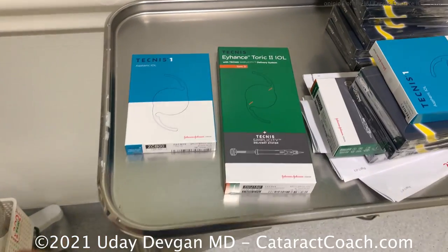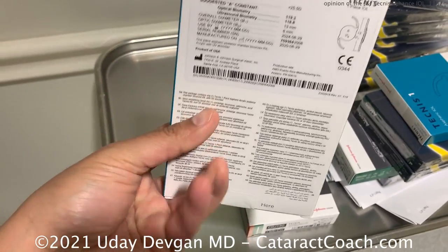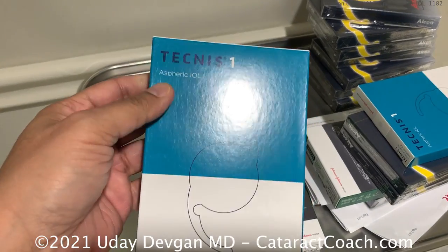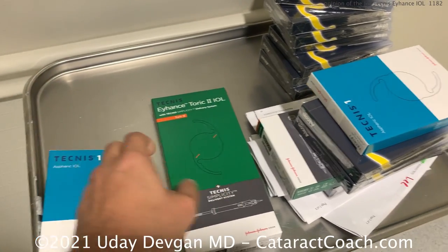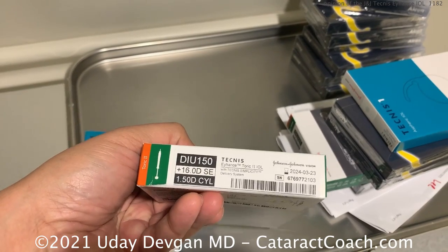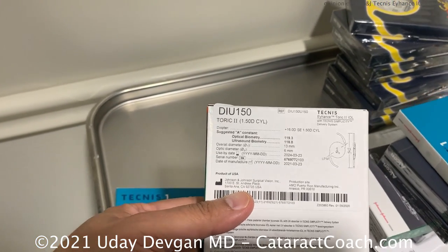So here we have the two lenses. There's the Technus ZC-B00 — the one with a long track record and excellent outcomes. It's a good lens, and we've enjoyed using it for many years. We'll continue to use it if we really want to emphasize the very best visual quality. Now, if patients are willing to sacrifice just a tiny bit of that far distance quality for slightly better intermediate range, the Eyehance is a great choice too. It now comes pre-packaged with a pre-loaded injector, and it gives about a half diopter at 67 centimeters.